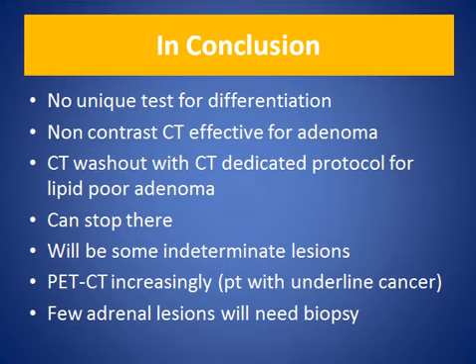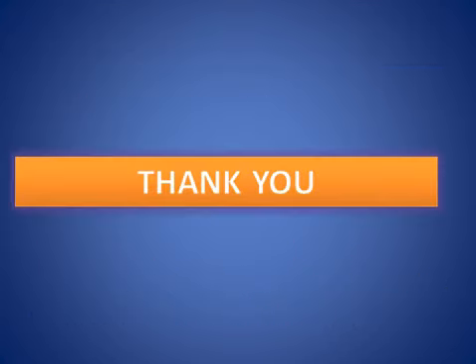In conclusion, there is no unique test for differentiation. Non-contrast CT scan is effective for adenoma. CT washout with a dedicated CT protocol for lipid-poor adenoma, and we can stop there. There will be some indeterminate lesions, where PET CT can be used with these patients. A few adrenal lesions will need biopsy.